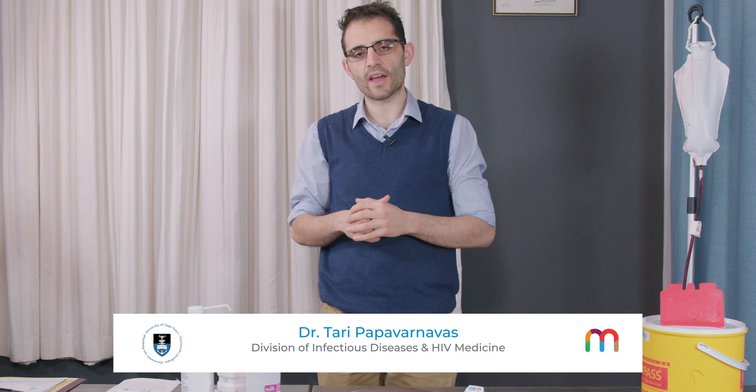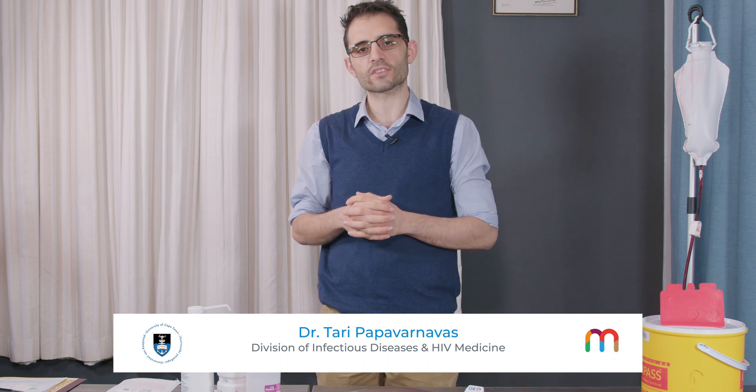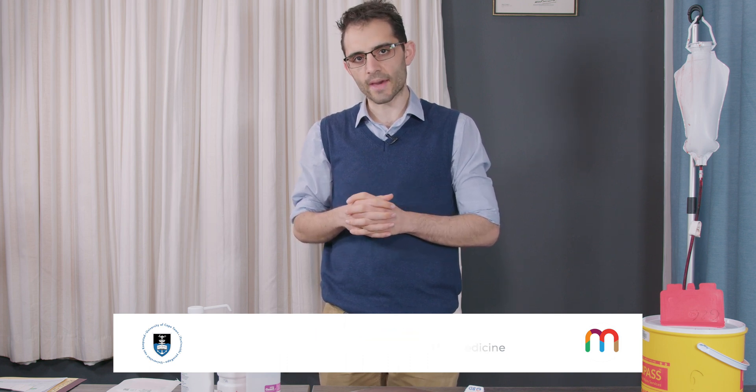Hi, my name is Tari Papavanavas. I'm an infectious disease fellow at the University of Cape Town at Kritteskir Hospital, and today I'm going to illustrate how to take a blood culture from a patient in a sterile manner.